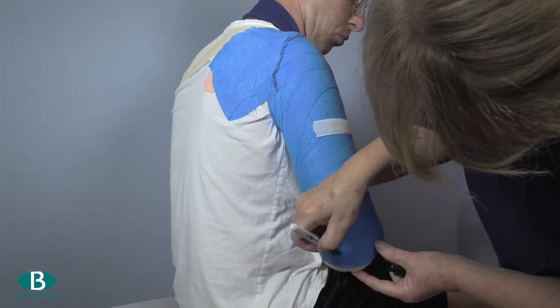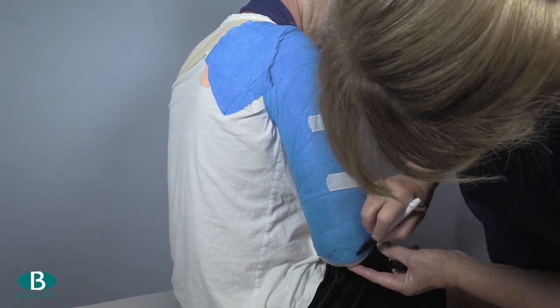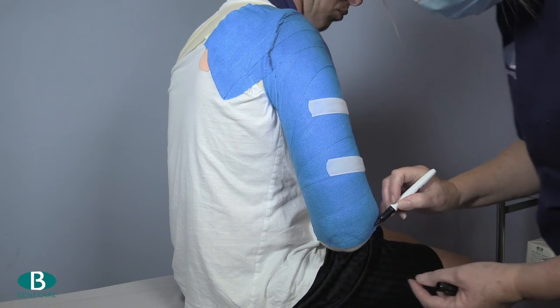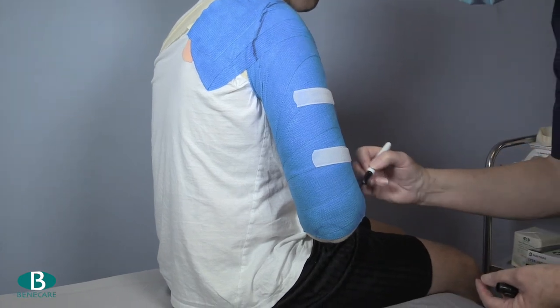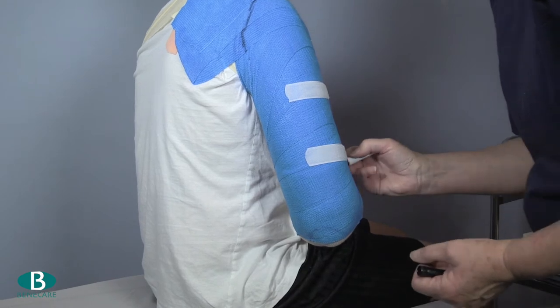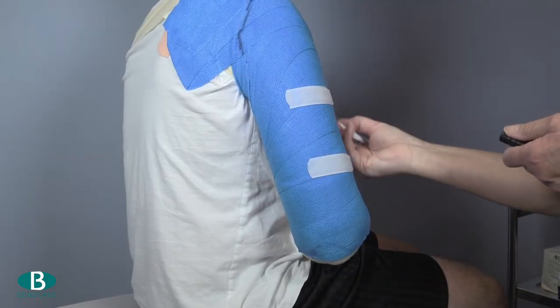At the distal end of the limb the cast should cover the epicondyles; however, the olecranon and the antecubital fossa should be free, as this will enable the patient to participate with pendulum exercises.